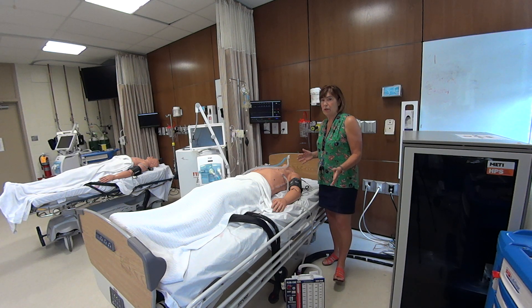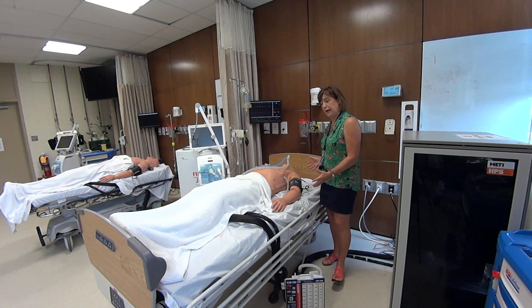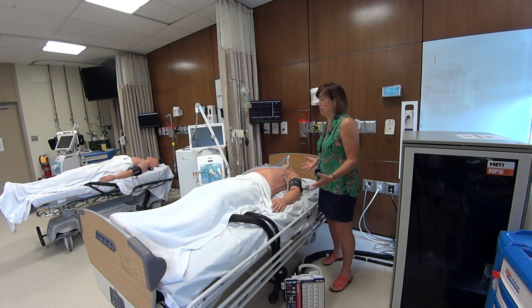The first thing we're going to talk about is: when you look at the patient, stand back and look at them and see what they have attached to them.